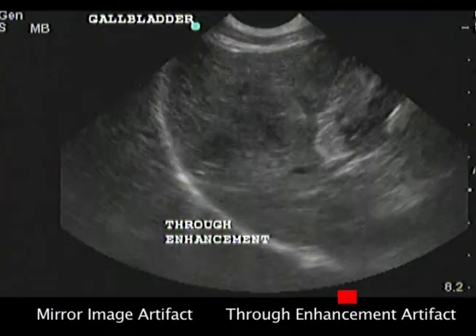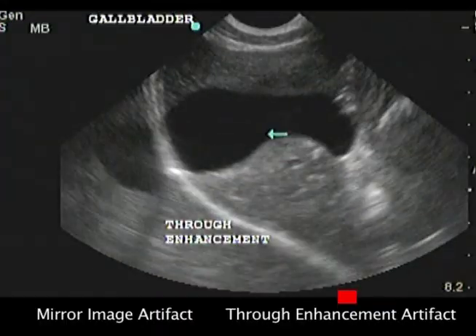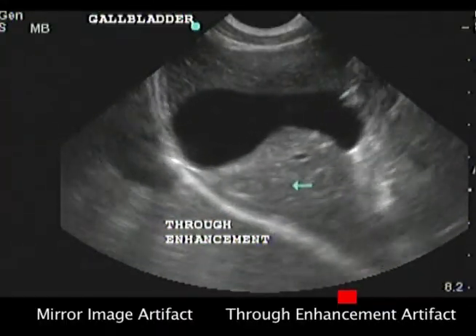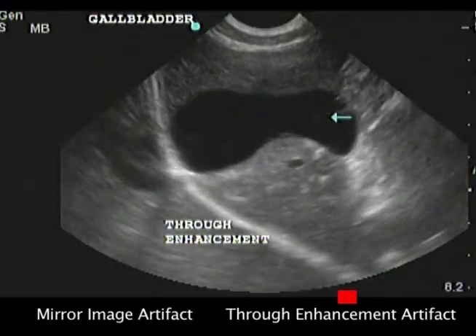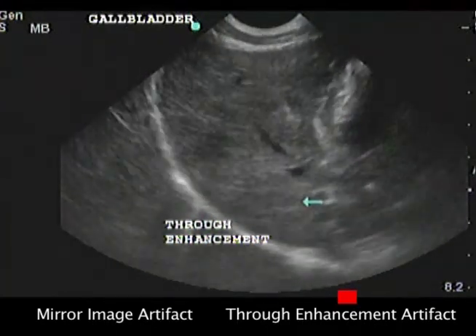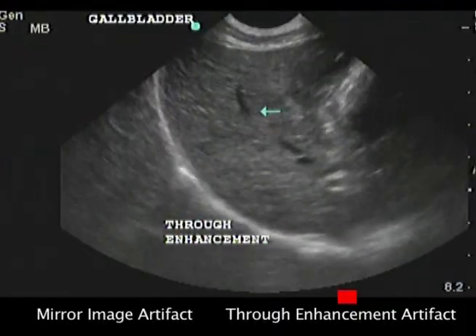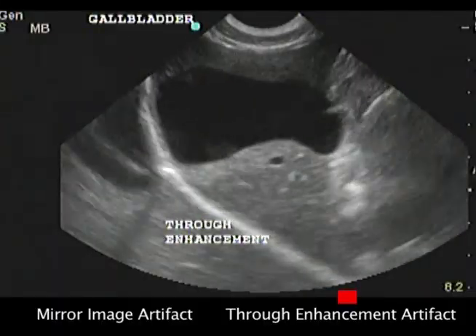In this video, liver dorsal to the gallbladder appears hyperechoic compared to liver ventral to the gallbladder. When we fan away from the gallbladder, the liver appears normal and homogeneous. Through enhancement artifact results from a lack of attenuation of the ultrasound beam as it passes through an anechoic structure like the gallbladder.